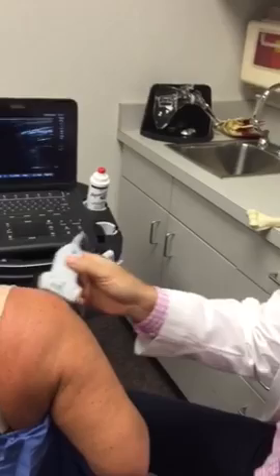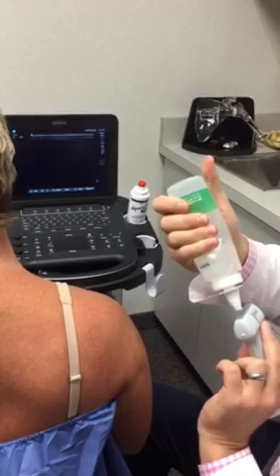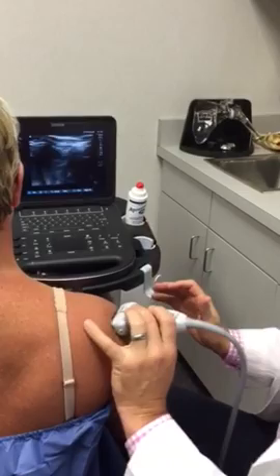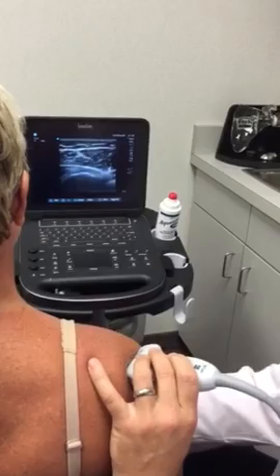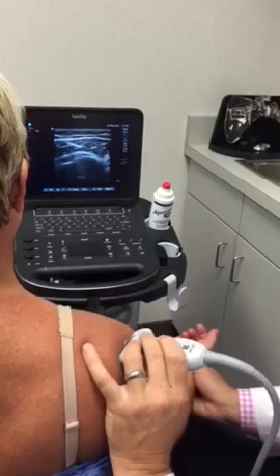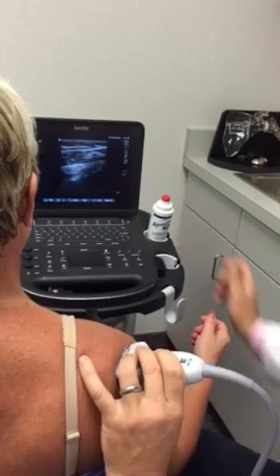The last part of examining the rotator cuff is coming up to the back to look at the infraspinatus and teres minor in the long axis. Feel the posterolateral edge of the acromion and pop the probe right there. This is the infraspinatus, and you can have the patient internally and externally rotate — you see the tendon moving with the humeral head. Going medial, this right here is the glenoid labrum, and you can see the cuff rotating with the humeral head.